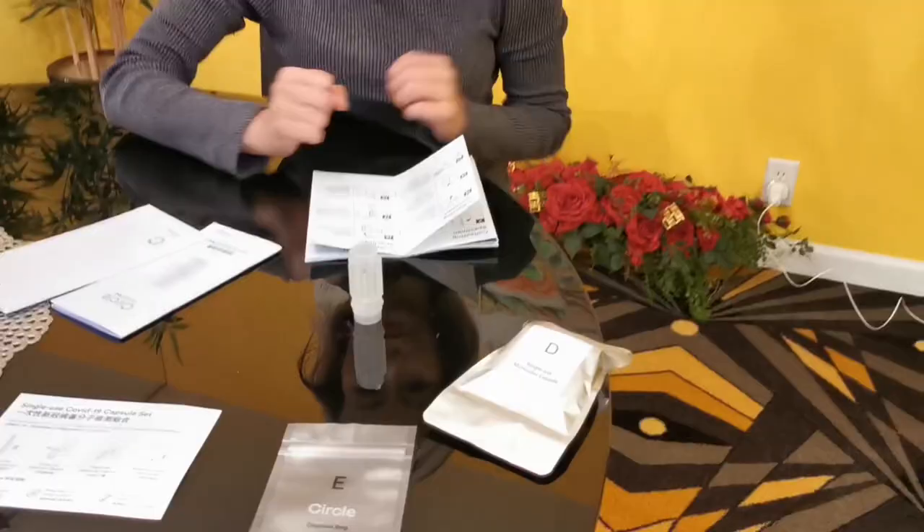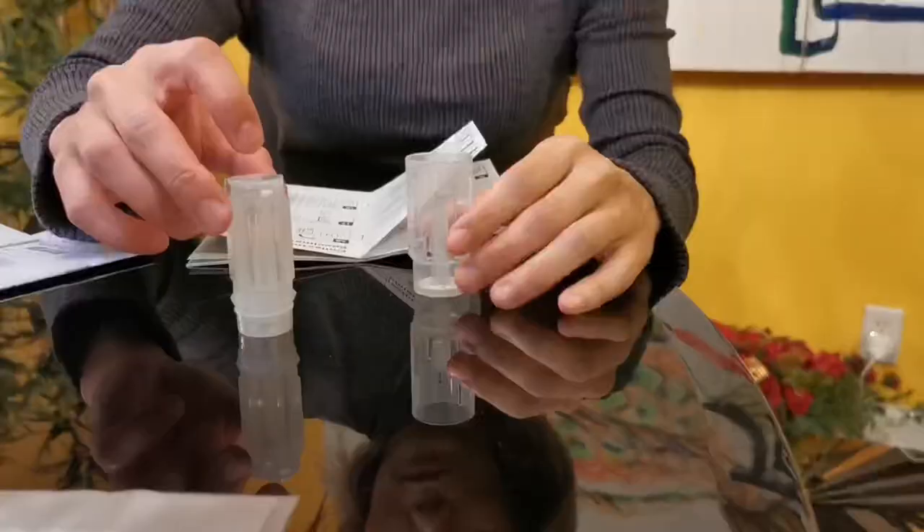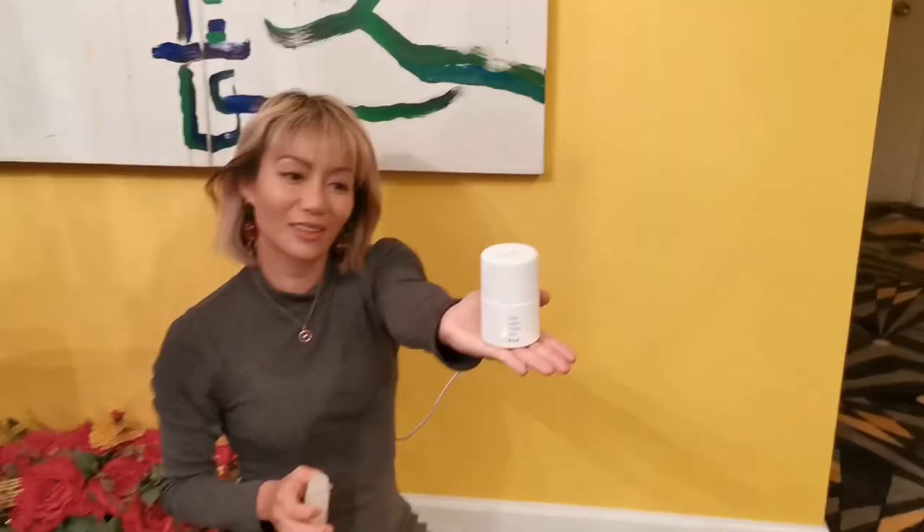Now we remove package D. And put the C into the D. The pot is ready.